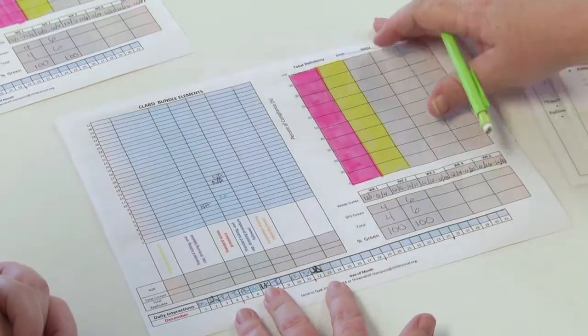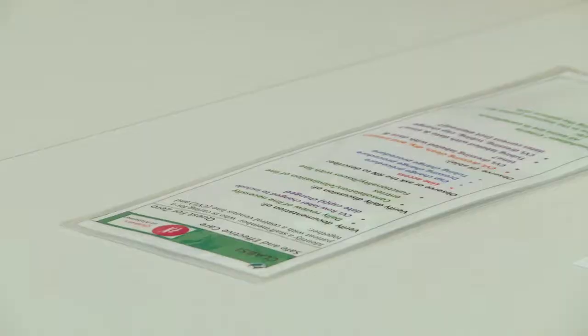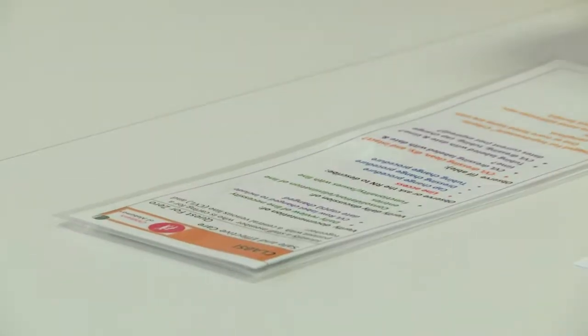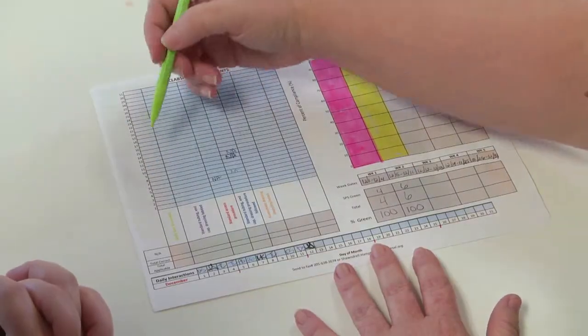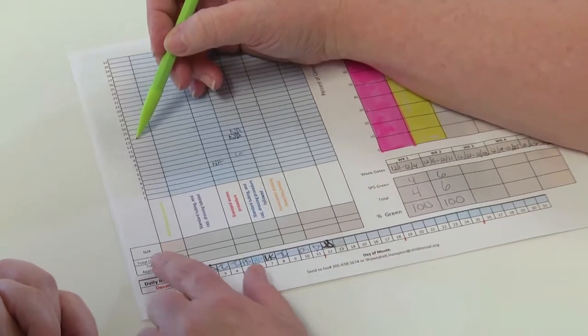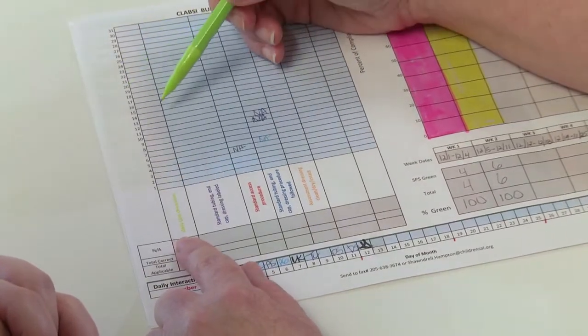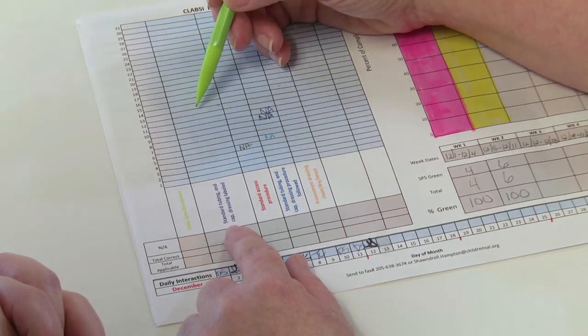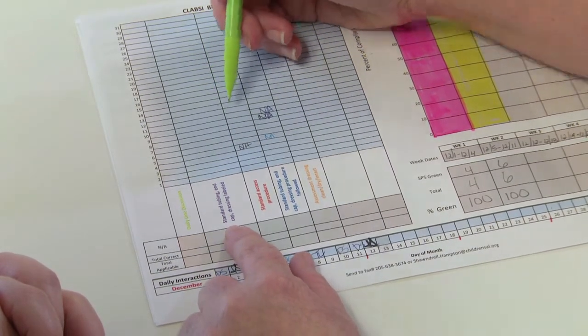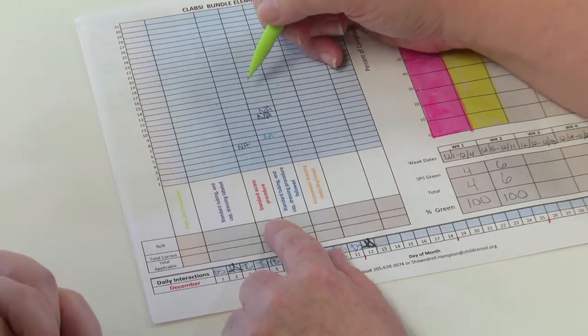Okay. Then I'm going to come over to our CLABSI bundle, and unfortunately today's interaction was in orange. Do you remember what the opportunity for improvement was? Yes, there wasn't a blue cap on my PICC, and I forgot that I needed to scrub with alcohol. Okay, great. That was a great learning opportunity. So today we're going to come to the date, and we're going to talk about what we did or didn't do. The daily line was discussed. The standard tubing and caps were all labeled. The procedure is where we had our error. We didn't do our scrub.